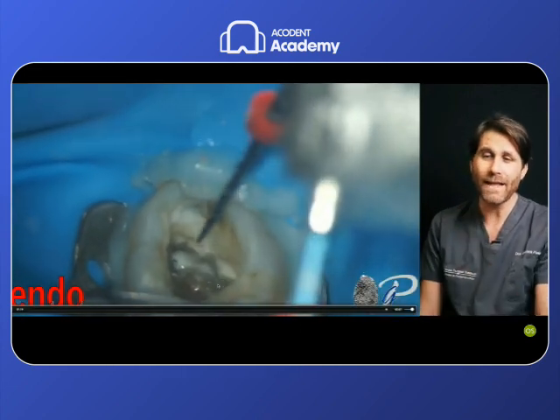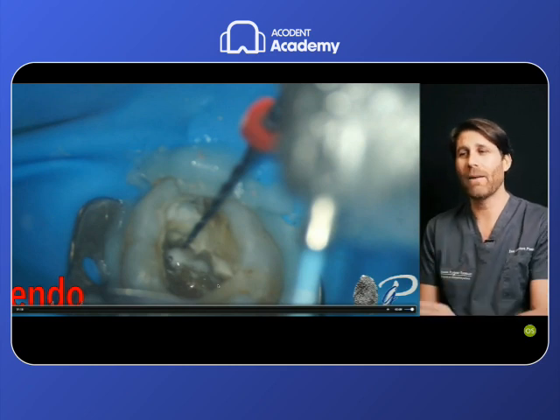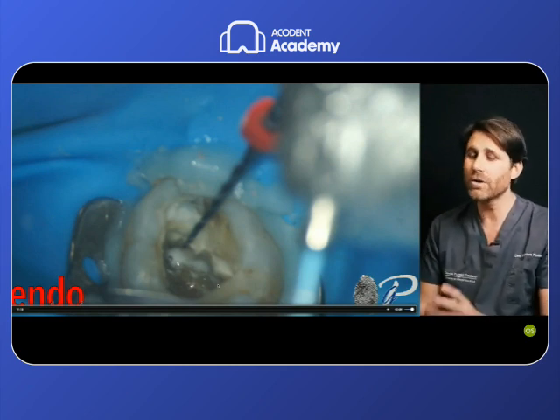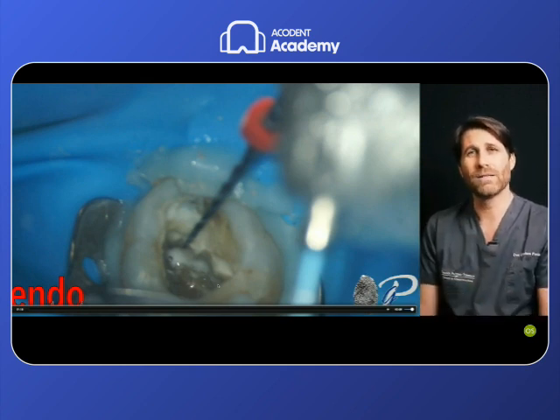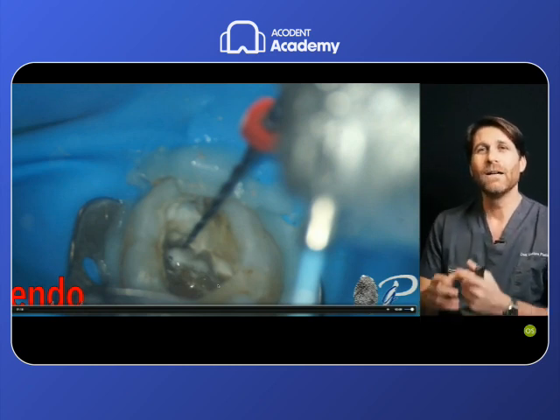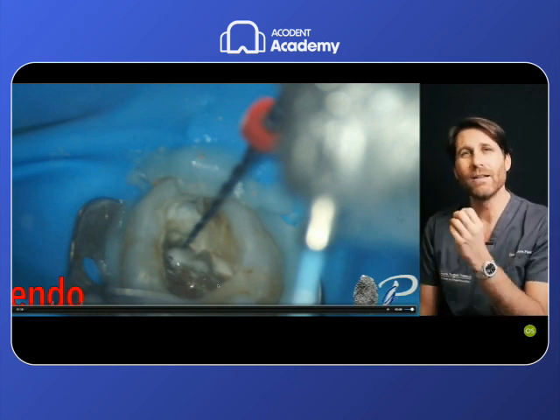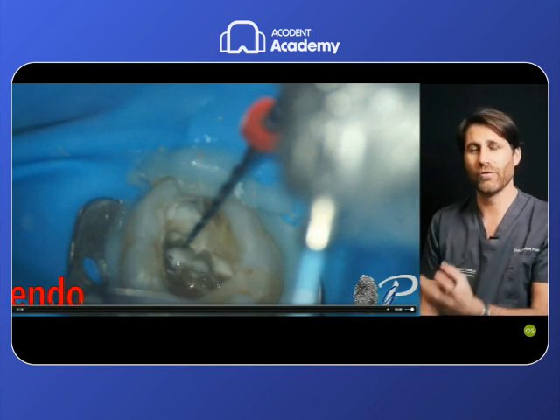So in this video, you have clearly seen how this technique can help us in scouting the coronally unscoutable root canal. I want to repeat the properties that this file has to help us perform this scouting in these particular situations. The big tip is big enough and resistant enough, and has enough power, to penetrate this hard dentin that occludes the coronal portion of the root canal.